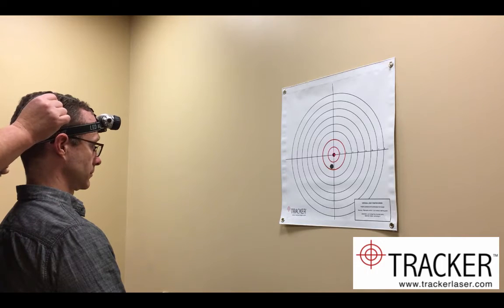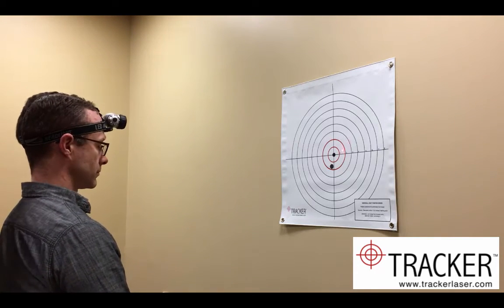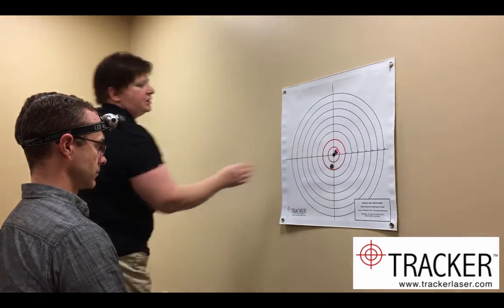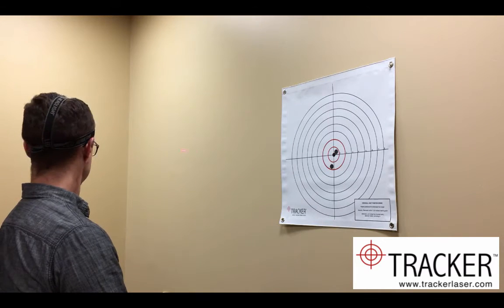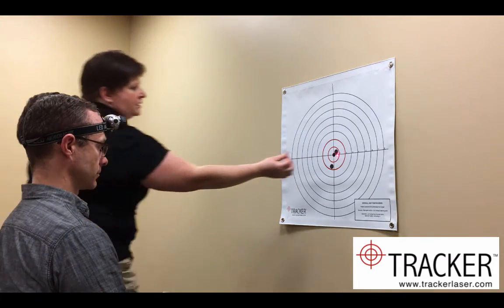Now recenter, close your eyes, turn all the way to the left, and come back. Good. Let's mark. The process is repeated: close your eyes, turn all the way to the left, and come back. Good job.